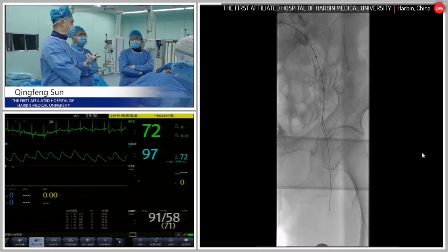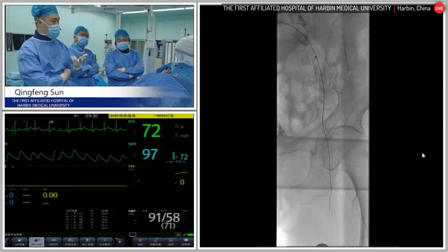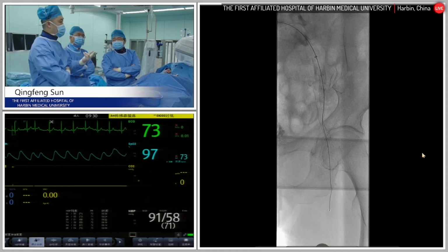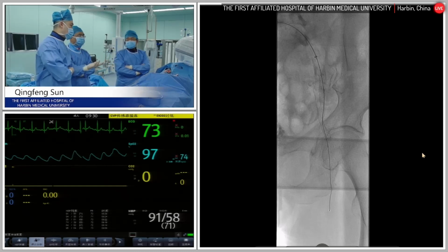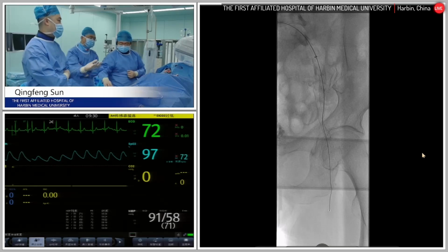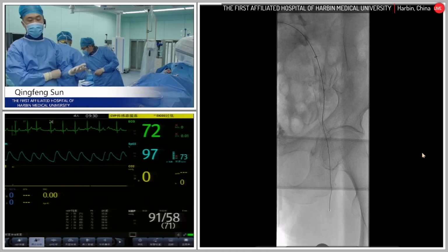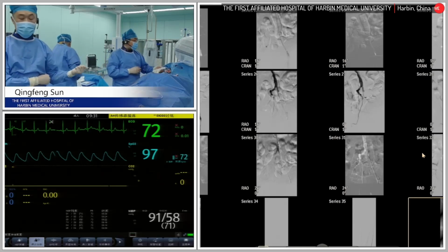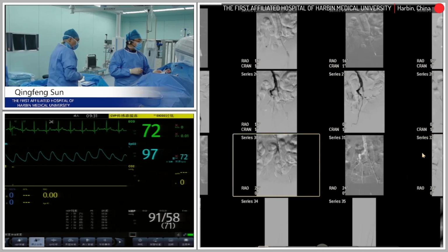The third one is for the debulking method for the iliac artery. It's still the same for the safety first. If you are debulking and the patient is severely calcified, it probably makes a perforation, which is very bad for us. You either have to emergency deploy the covered stent, or you have to go in open for the open surgery. And for this kind of age, an 85-year-old gentleman, you are going open surgery, which is actually killing him, right? So what's the next question?